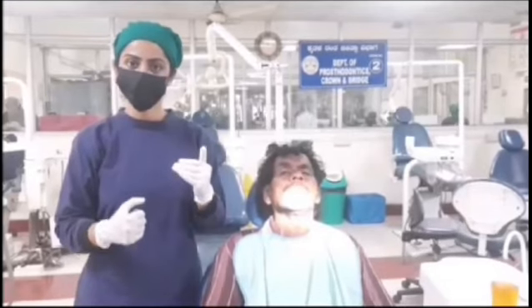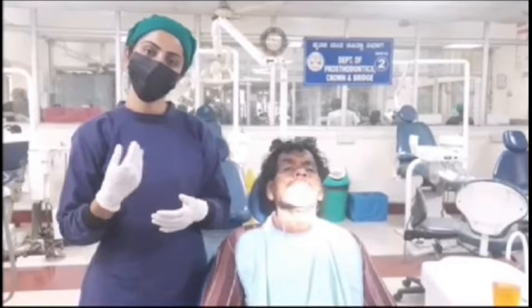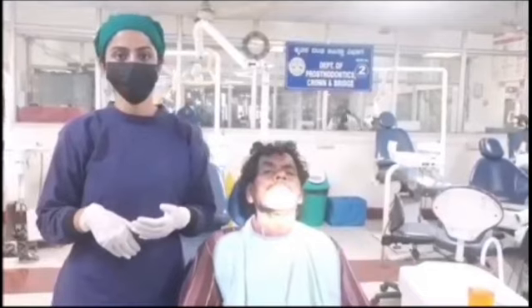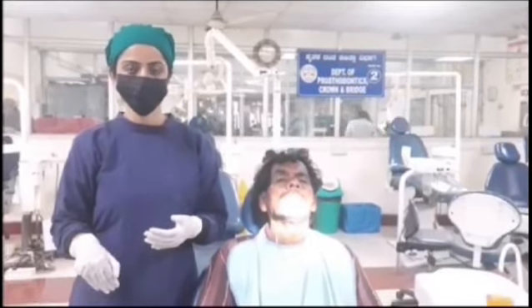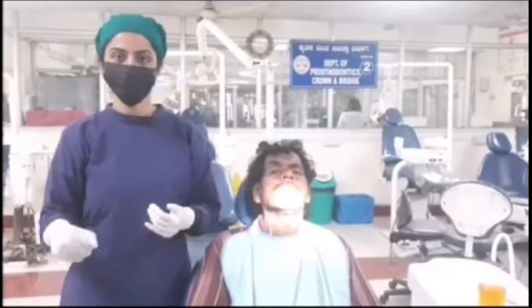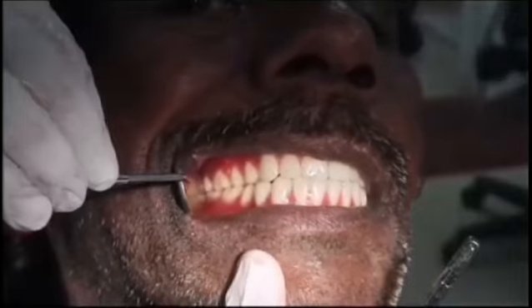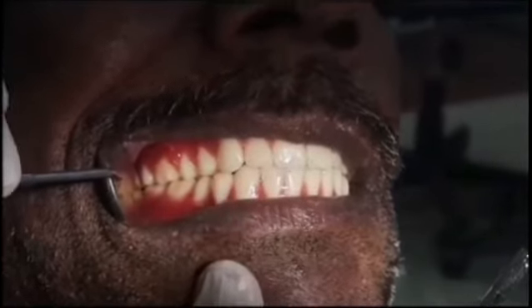Evaluating both dentures together. Occlusion and jaw relation. Horizontal relation. The patient is guided into centric relation using any method to retrude the mandible. Errors in centric relation: observed if space exists between upper and lower posterior teeth at first contact, or if the lower teeth slide over the upper teeth on first contact. Vertical relation. Vertical dimension is evaluated using the method. Teeth are removed, replaced by wax occlusal rim, and a new record is made.